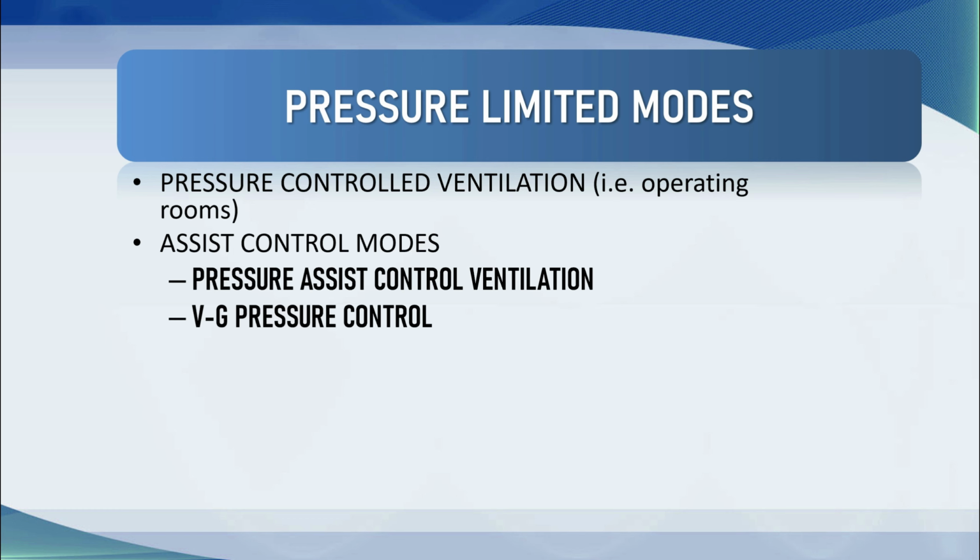So every breath is essentially a facsimile of every other breath, but the tidal volume will vary from breath to breath because the patient augments the pressure ramp when they take a slight negative deflection on inspiration.